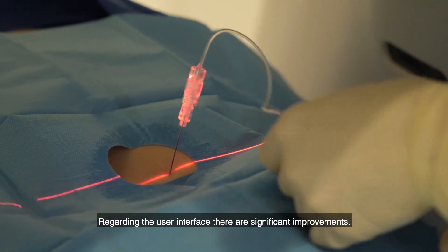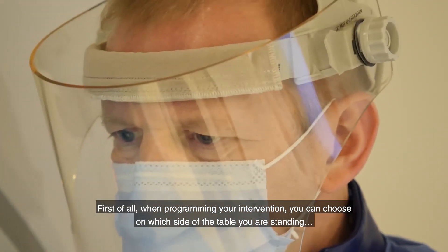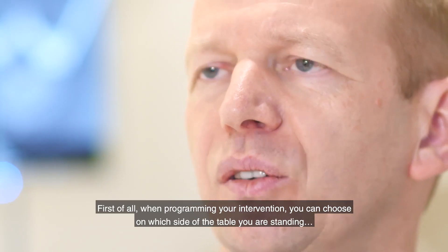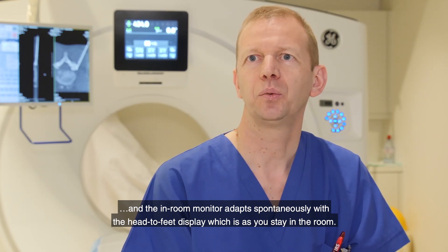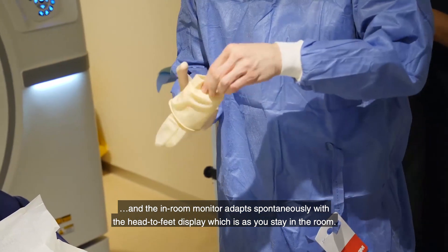Regarding the user interface, there are significant improvements. When programming your intervention, you can choose on which side of the table you are standing, and the in-room monitor adapts spontaneously with a head-to-feet display oriented as you stand in the room.